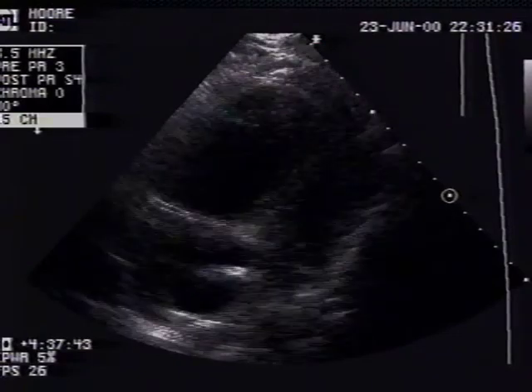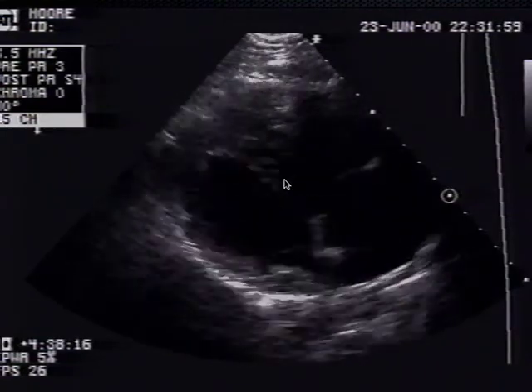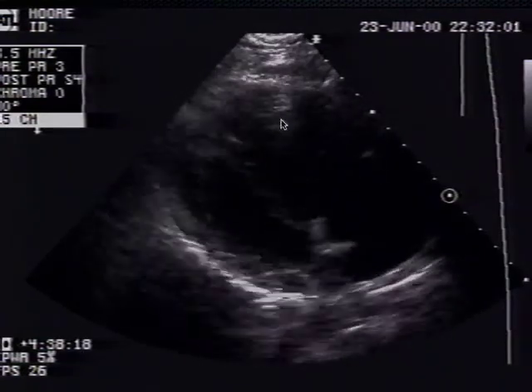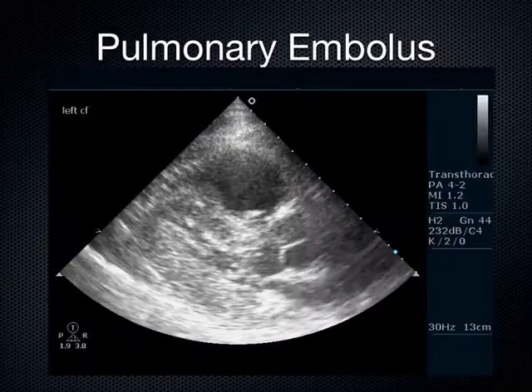This is another patient who we're trying to do, this is not pretty, but it's an apical 4 chambered view. It's an old scan. This is the right ventricle, this is the left ventricle here. I'll let this play itself out for you. LV smaller than the RV. Here's the parasternal long axis, big RV, small LV, in this patient with basically pulmonary embolism.